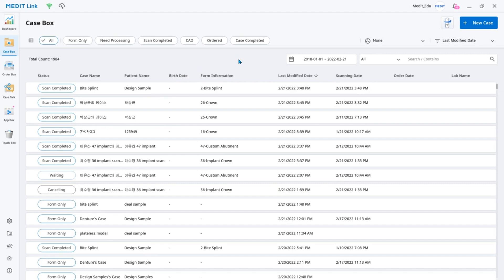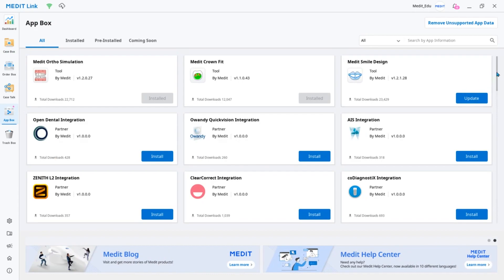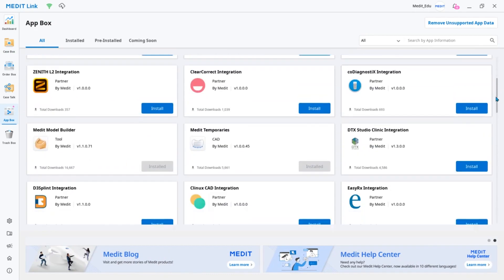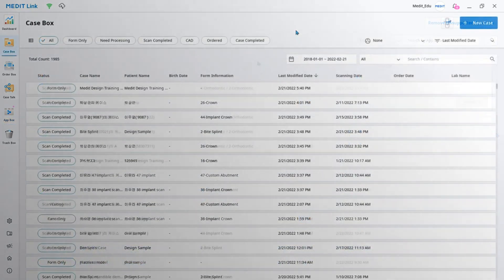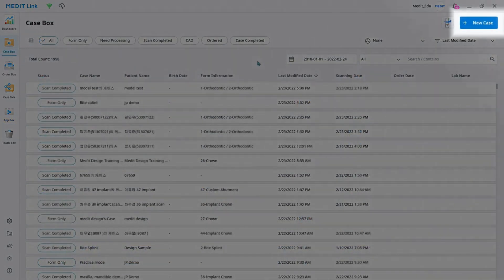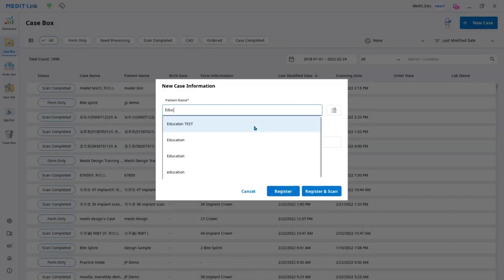If you still don't have Medit Design, go to the App box and install the latest version of the app. To run the app, create a new case and click the Medit Design icon on the top.